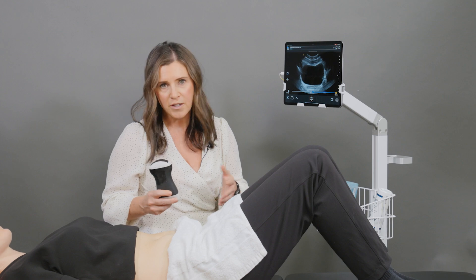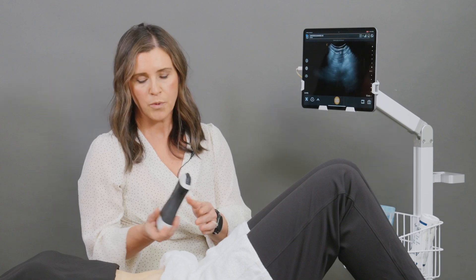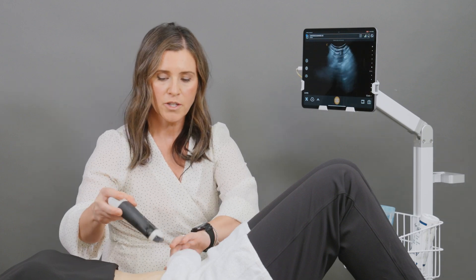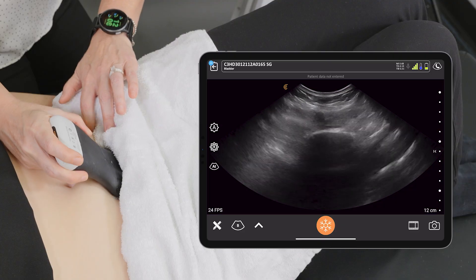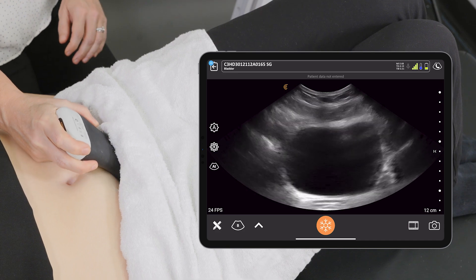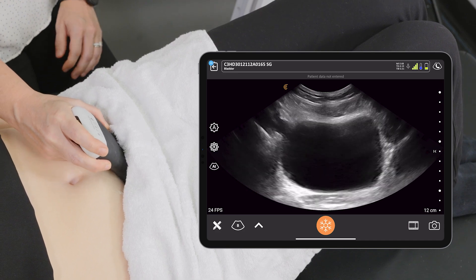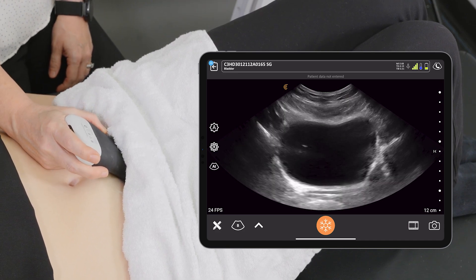We're going to start with our client in a crook-lie position. We're going to use the voice control today, so I'm going to unfreeze the image. We're going to place the probe with the marker to the patient's left and we're going to get a clear image of the bladder so that we can see all four sides of the bladder.